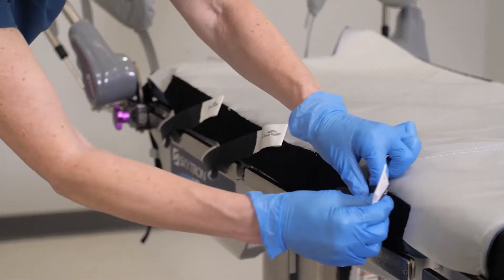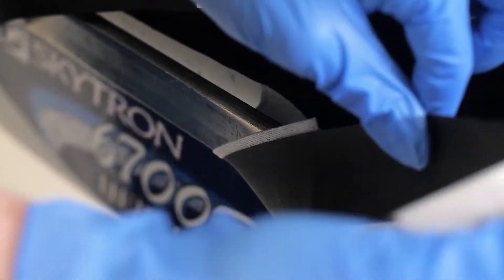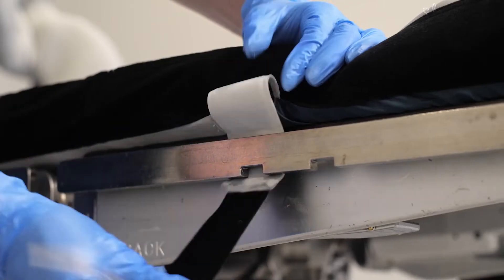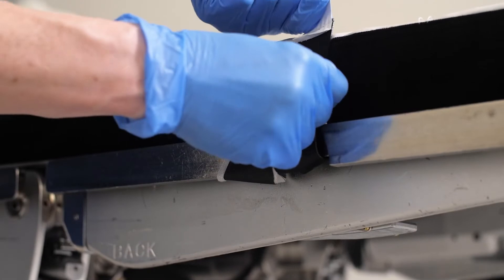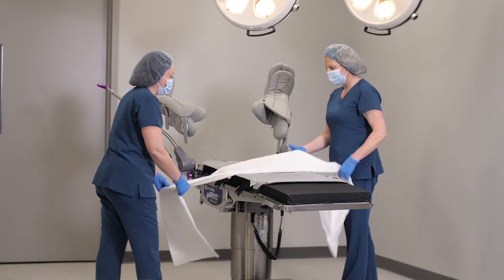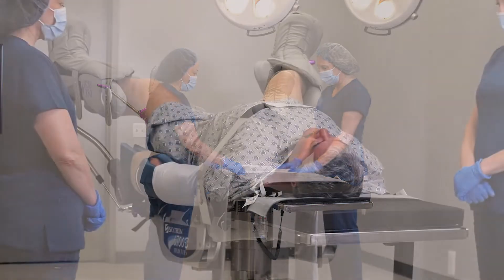Loop the rail fasteners located along the sides of the mat behind the rail, then attach them to the fastening strip. Ensure the rail fasteners are looped before the rail post for procedures that require Trendelenburg positioning. Loop the foot end straps, which are located at the bottom of the mat, around the footboard pegs — the footboard pegs should be pointing down. Note that the rail fasteners and foot end straps may be double looped around the OR table rail to accommodate different table configurations. A draw sheet can be placed in the area supporting the patient's iliac crest and abdomen for repositioning and to support arm adduction.